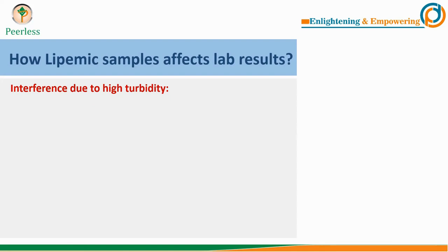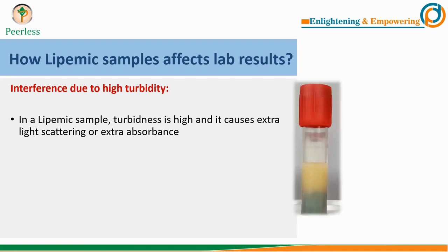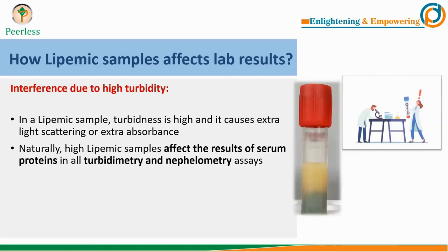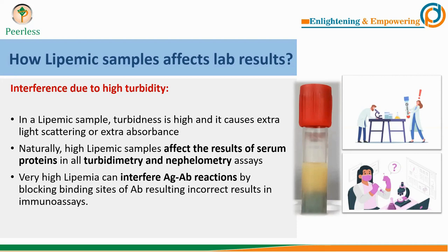There are three ways lipemic samples affect lab results. Firstly, in lipemic samples turbidness is high, causing extra light scattering and extra absorbance. Since turbidimetry and nephelometry tests are based on absorbance and scattering results, all serum protein assays are affected by lipemic samples. Additionally, very high lipemia can interfere with antigen-antibody reactions, and hence it can affect immunoassays as well.